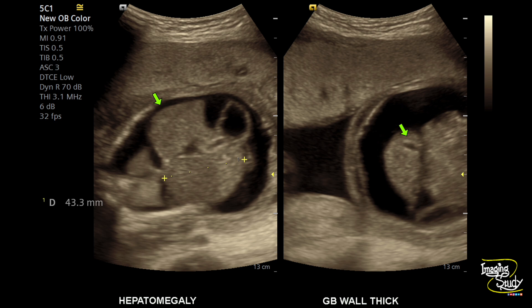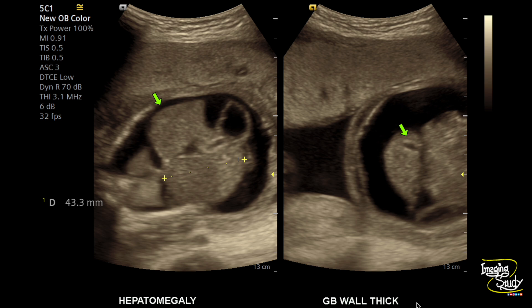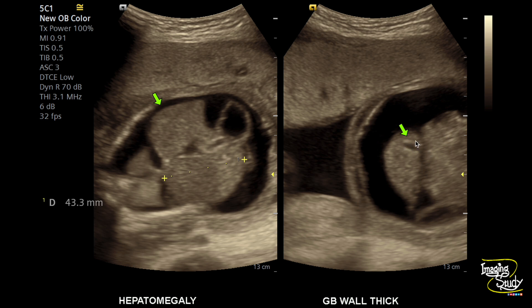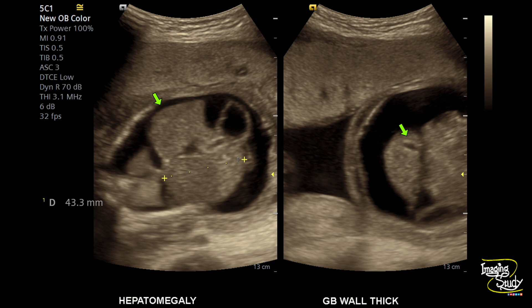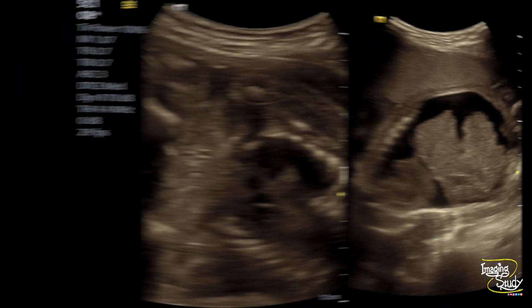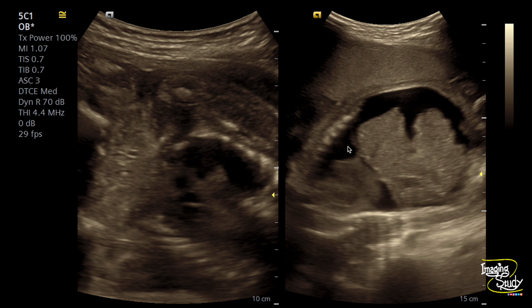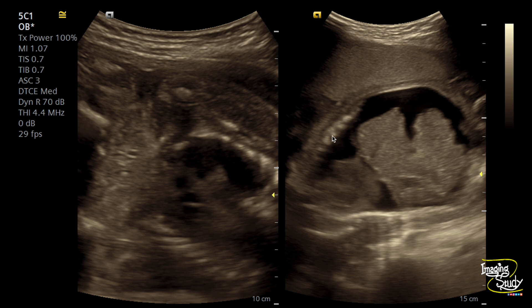Another picture shows a large liver, where we have tried to measure the longest superoinferior diameter. On the right image, you can see that with huge ascites there is also gallbladder wall thickening. In adult patients, when you see ascites with liver abnormality, the gallbladder wall commonly becomes edematous and thickened — so do not forget to check for gallbladder wall thickening in cases of fetal ascites. Another picture confirms bilateral pleural effusion with flattening of the diaphragm, enlarged liver, small bowel, ascites, and generalized skin thickening.